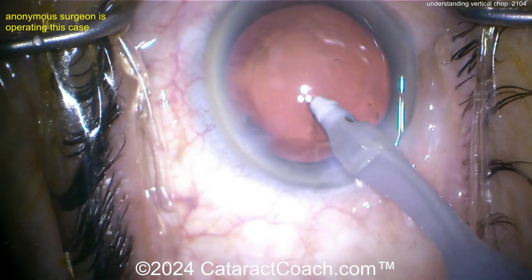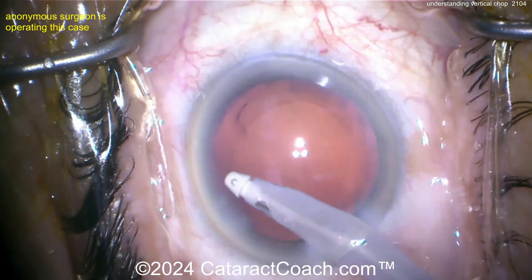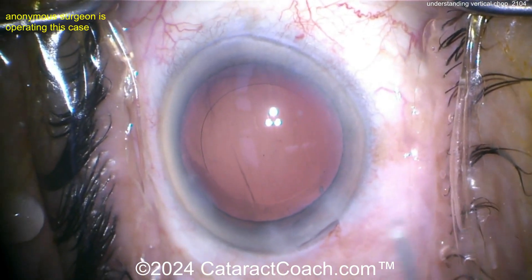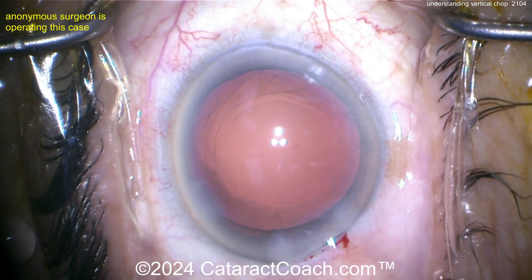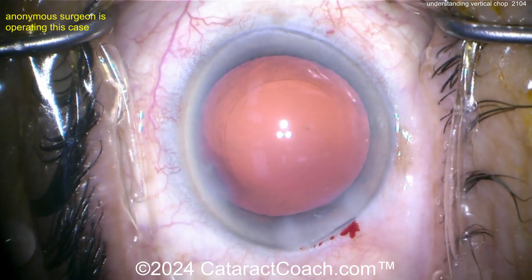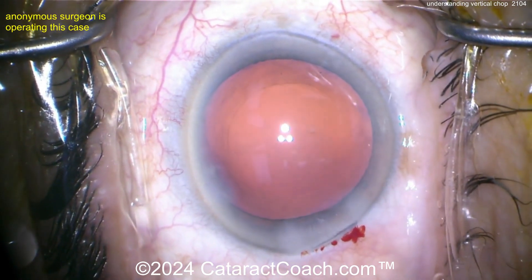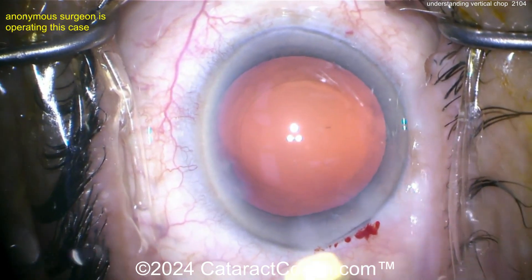Now finishing the case and taking out the cortex. You might wonder — what's combo chop or other chop variations? They're all just variations on the same principle: a mechanical splitting of the nucleus into smaller pieces, also called nucleofractis — fracturing the nucleus. You hold the nucleus with the phaco probe using vacuum, then use the chopper to mechanically split it, whether horizontally, vertically, or a combination.